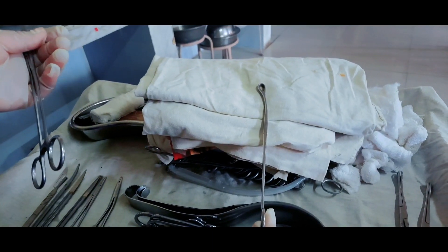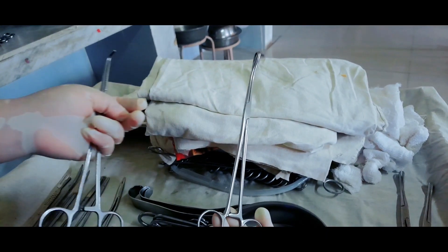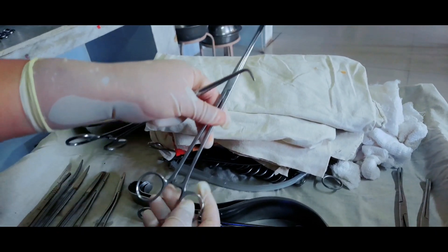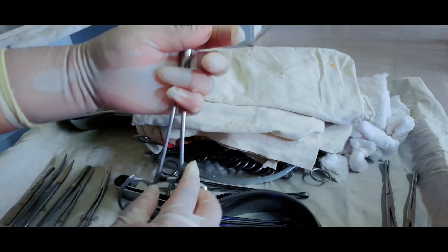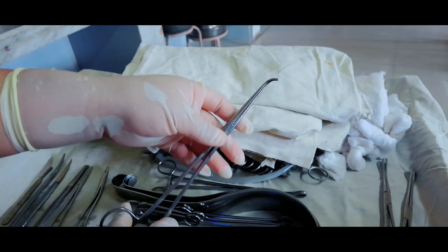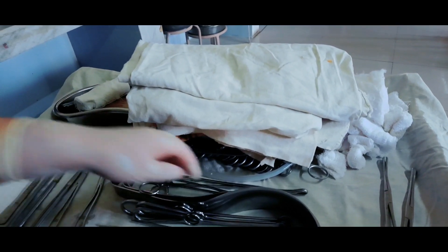Gallbladder holder — it looks like a sponge holding forceps but is slightly different because at the end it is a little bit curved. Right angle forceps, which has many purposes in all types of operations.